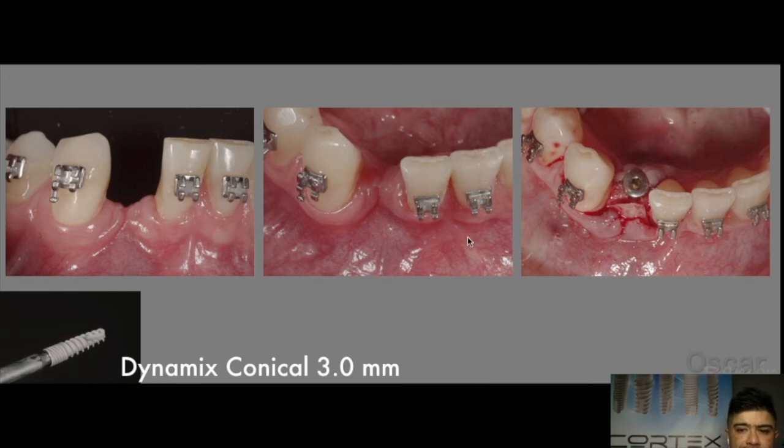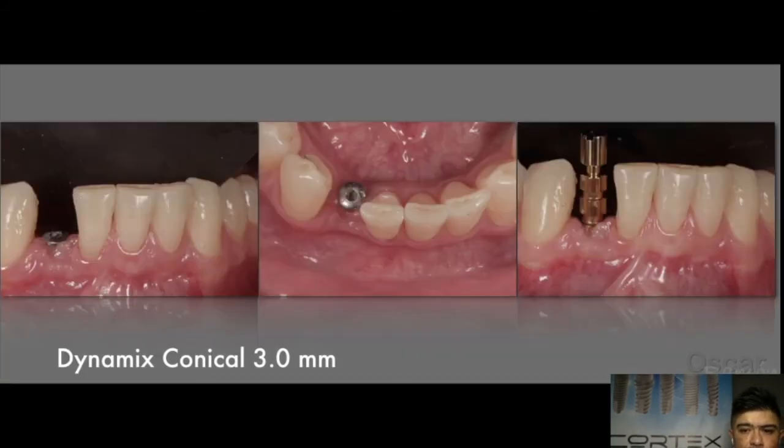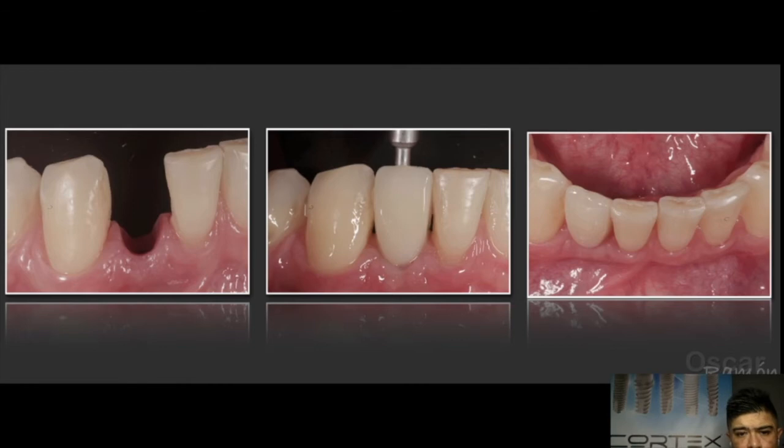Also in this case, in the lower incisor, we insert the 3.0 implant with a connective tissue graft in this area. And after the healing time, we have the final restoration, and you can see the nice response of the soft tissue.